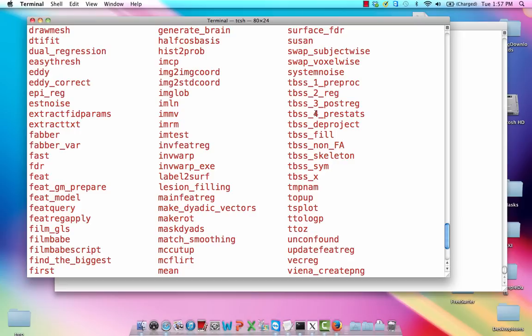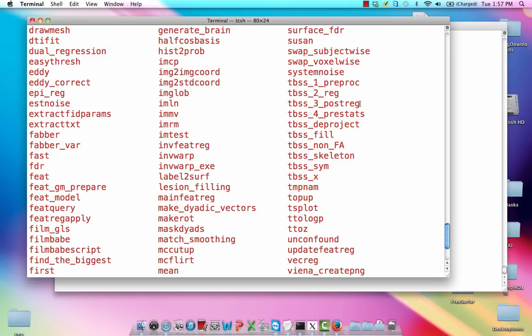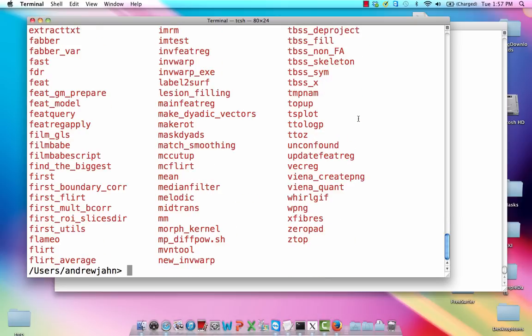Again, we run these sequentially. It's very helpfully labeled. Preproc is going to do some more erosion of the mask to get rid of any artifacts at the edge of those FA maps. And registration, post-registration, just like in traditional fMRI analysis. You're going to estimate some warping parameters to a standardized space and then apply it with this post-reg command. And lastly, pre-stats is going to project all this pre-aligned FA data onto this tract skeleton, which we'll see in just a second.